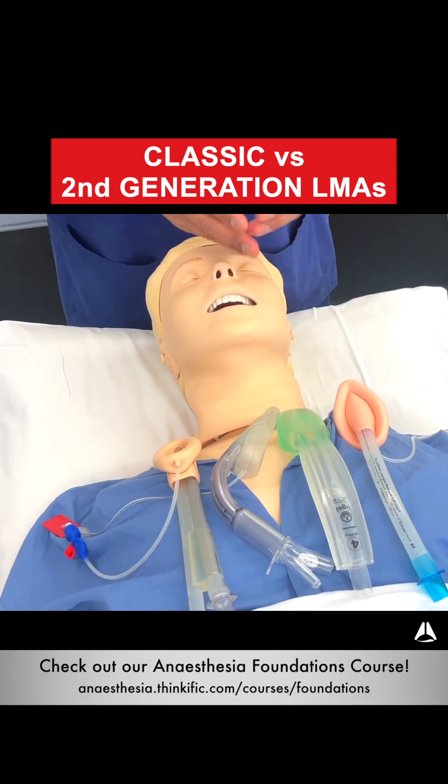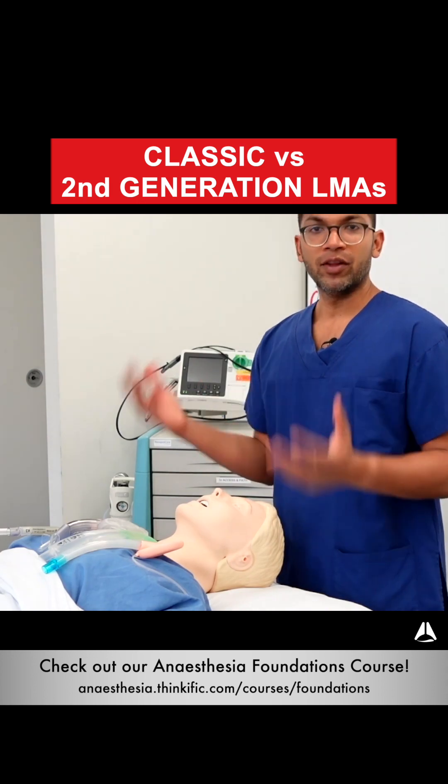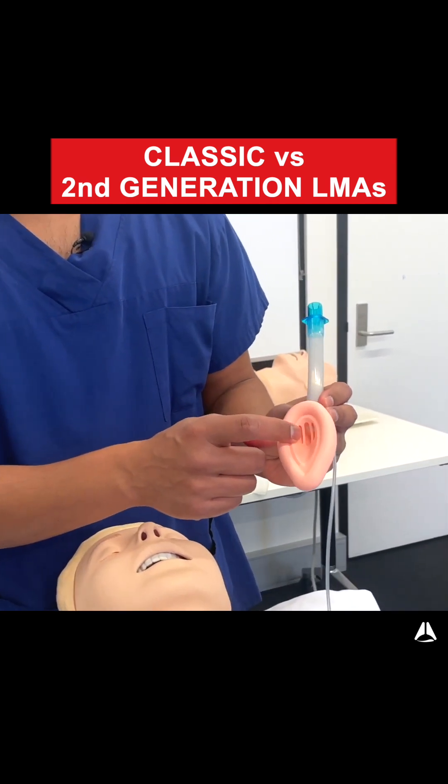There are quite a few second generation LMAs, including the iGel, the Supreme, and the ProSeal, and there will probably be more on the market as well. The classic LMA is essentially this airway tube with an inflatable cuff and an aperture through which you can ventilate.